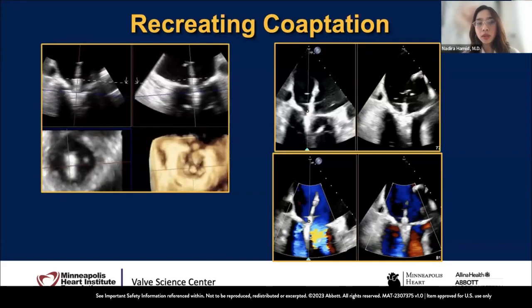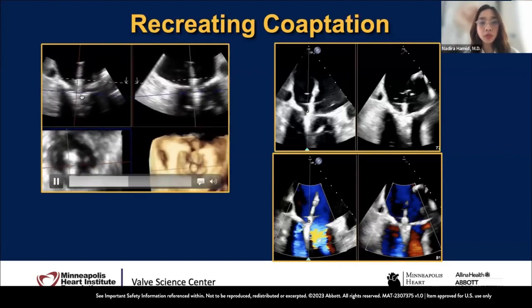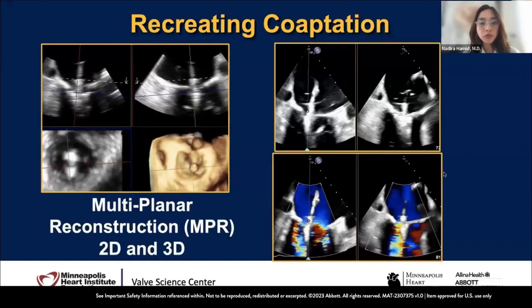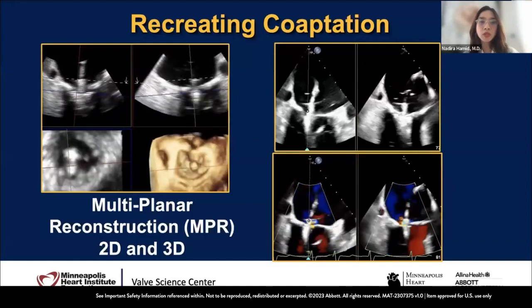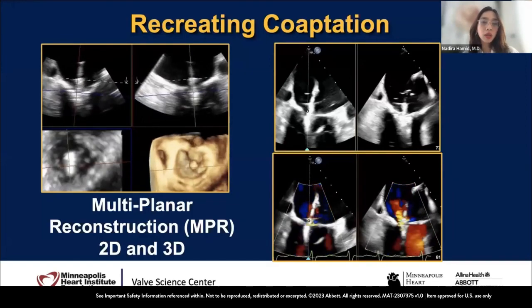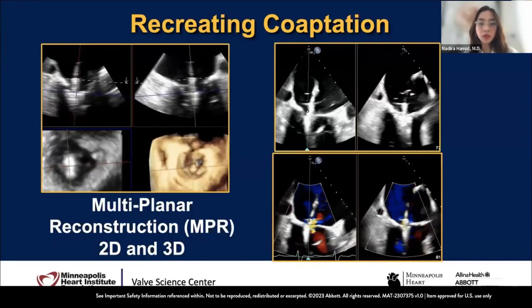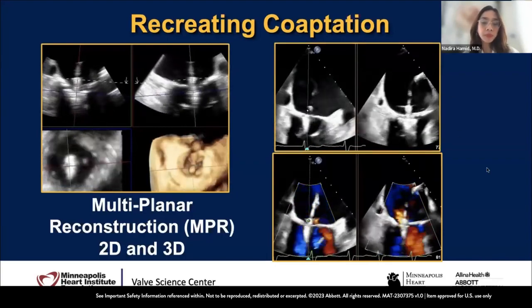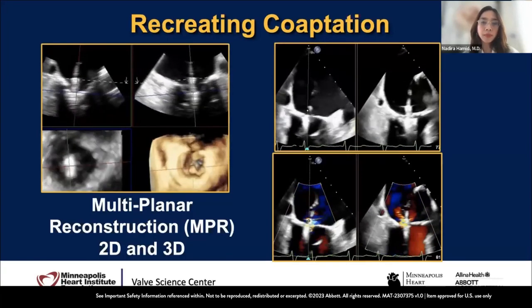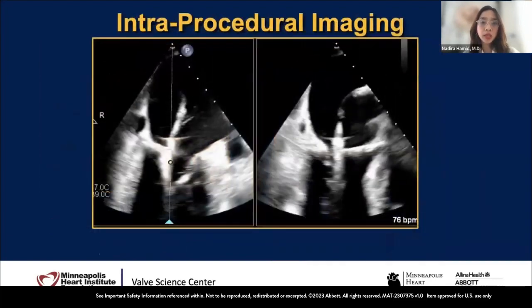And so as he pulls up, once you're in the same spot, you can see the leaflets in the arms. Most of the time you can do this on 3D MPR, but with the resolution, just be very careful. It may be a little bit hazy. It's not as clear as on 2D imaging because of the resolution. So sometimes I will switch back to 2D, long axis view or biplane, while he's closing the clips to ensure that leaflet grasp.